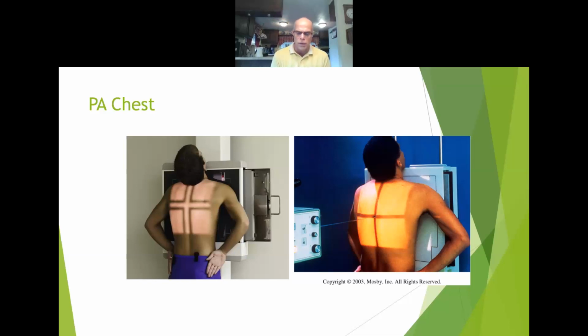But under breathing instructions on page 105, it says, during normal inspiration, the costal muscles, meaning ribs, pull the anterior ribs superiorly and laterally. The shoulders rise and the thorax expands from front to back and from side to side. Deep inspiration causes the diaphragm to move inferiorly, resulting in elongation of the heart. Radiographs of the heart should be obtained at the end of normal inspiration to prevent distortion.